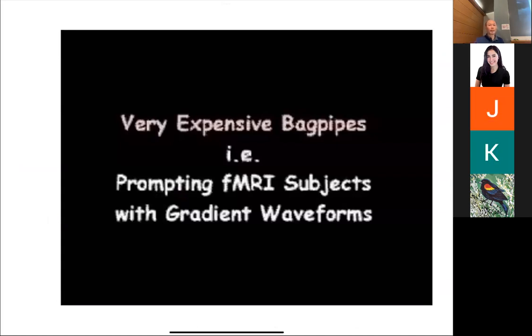So that gives you frequencies in the kilohertz range, which means you can hear these gradients, okay? That's actually a characteristic of MRI: it can be quite a noisy modality compared to the other modalities. For researchers, it's interesting because once you know what pulse sequences are, as you're lying in the scanner, you can actually tell what they're doing, right?